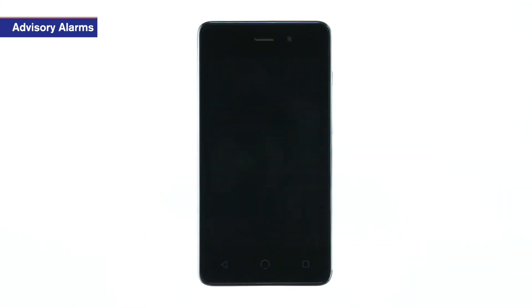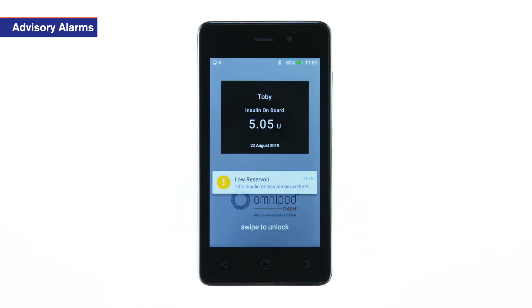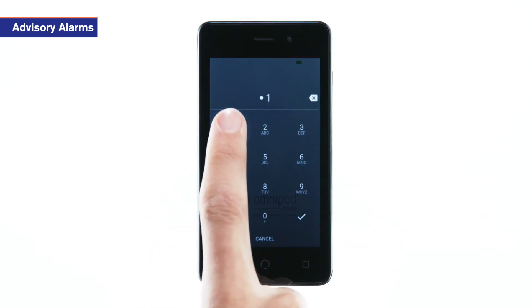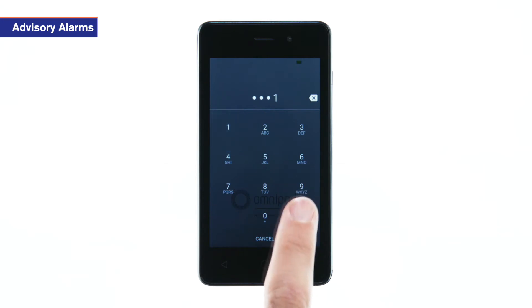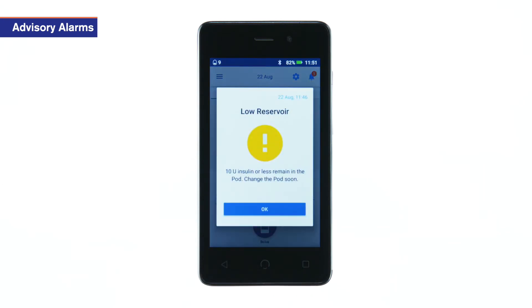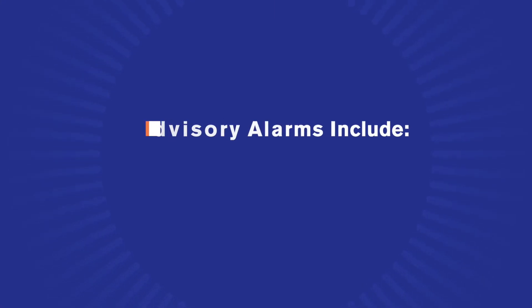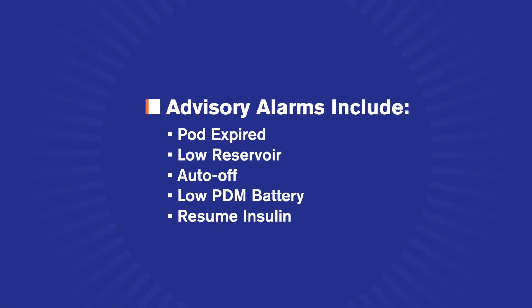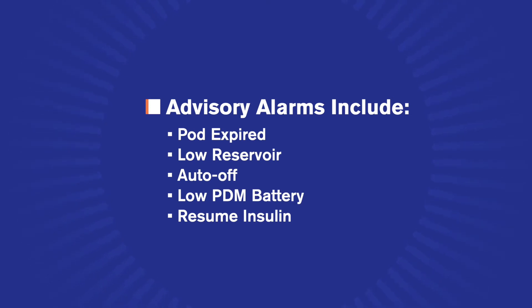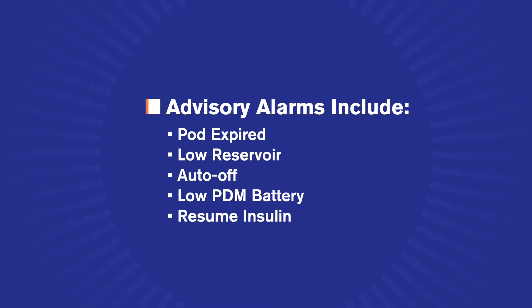When you hear an alarm, wake and unlock the PDM and read the on-screen message. Advisory alarms include pod expired, low reservoir, auto off alert, low PDM battery, and resume insulin.